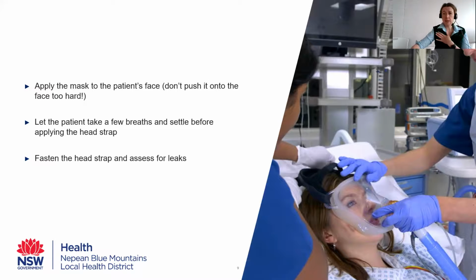My personal practice, and that's not set in stone, it's not right or wrong, but my personal practice is to just hold the mask firmly with my hand until the patient gets used to what it feels like. I find that it actually increases the success rate of them being okay with the therapy. It feels very uncomfortable, and again, it can be very claustrophobic.